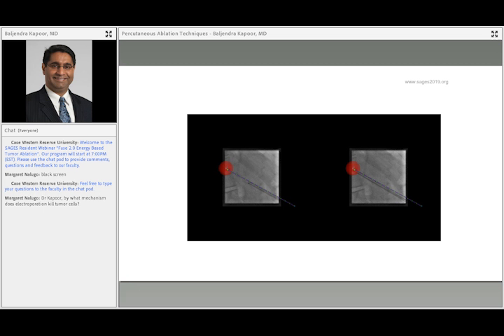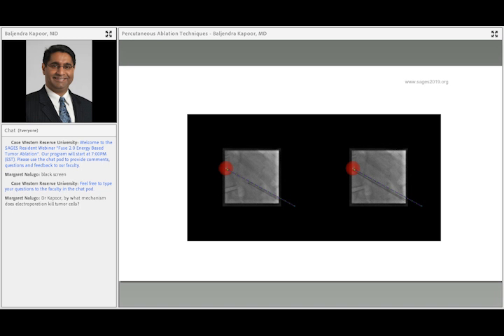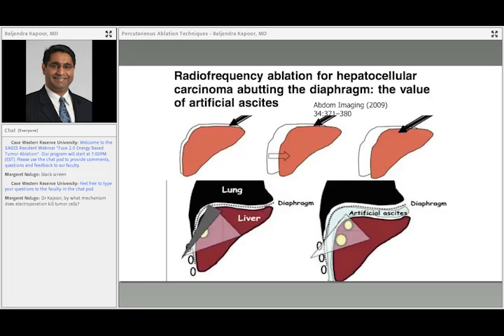Here are two different views, what we call the bull's eye, that was the previous one, and the progression views. Here you can see that I was able to get to the target tumor. These are the different sets of images. Intraprocedurally we did a non-contrast cone beam CT, and you can see the probes right in the area of the tumor. And this is the 11-month follow-up. There's complete necrosis in the ablation of the residual disease. No residual disease is left. So these are some of the new tools that we now have in angiosuites.